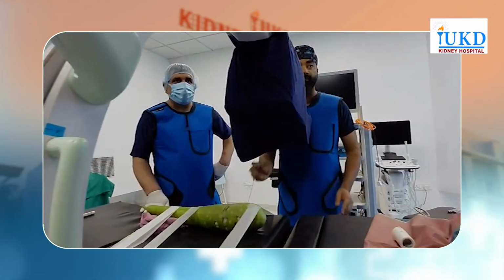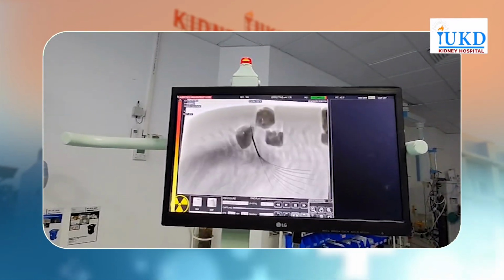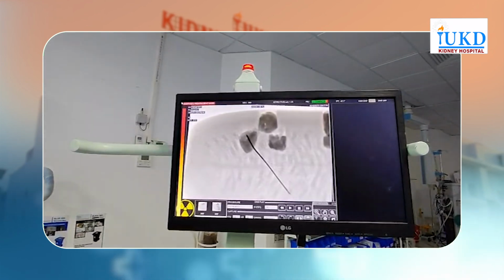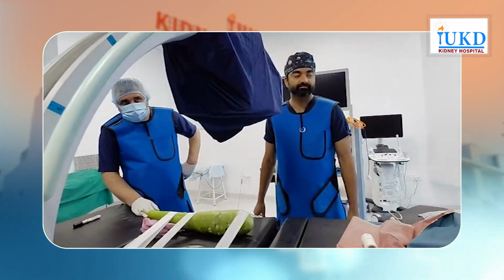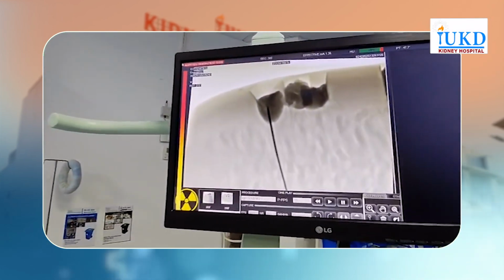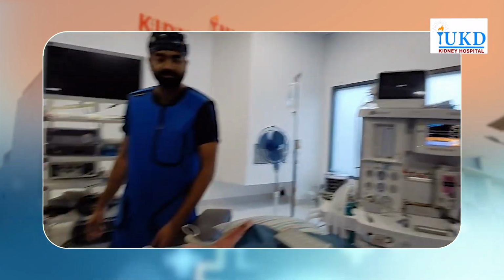So see, I am up. Okay, so I'll come down. I'll adjust my angle toward deep and I'll try to hit the cotton again. Make 0 again. Show me. Yeah, this is the perfect place. If you push it, the contrast will come out. This will come. Yeah. Okay, I will try.